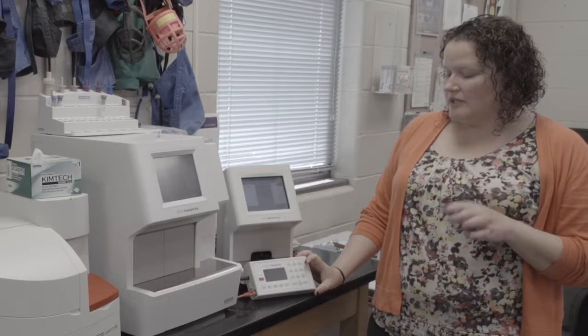So important things, don't use an excessive amount of alcohol when you're drawing for these. That can actually affect your results when you're putting the blood into the blue top tube. And then make sure that your sample has mixed for at least 5 minutes in your blue top tube prior to running, just so that you get a well-mixed sample.